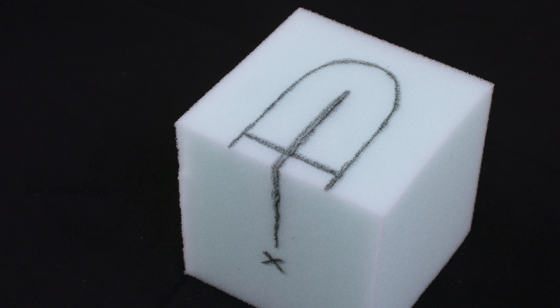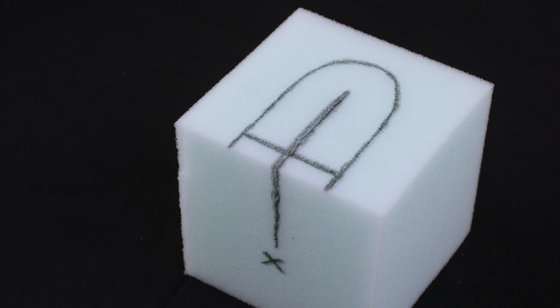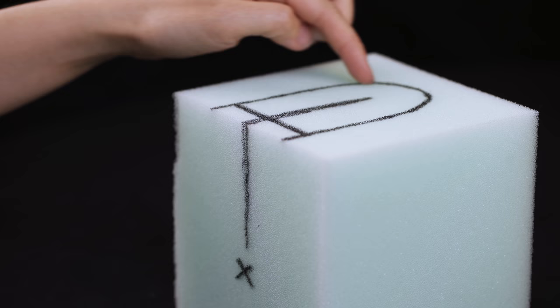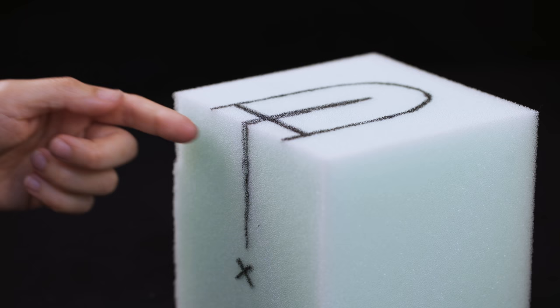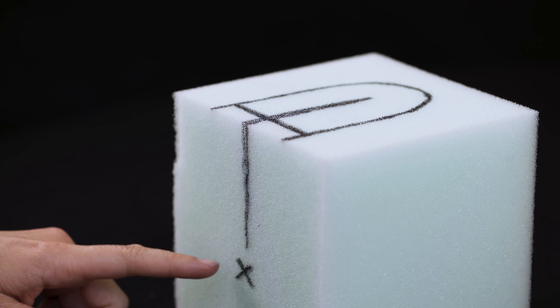This foam block represents the female perineum. The top surface of the block represents the posterior vaginal wall. I've drawn out the edges of the vagina and the hymen, which is represented by the short horizontal black line. The front face of the block represents the female's perineum which is facing you. The black X is the anus.